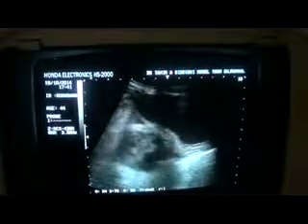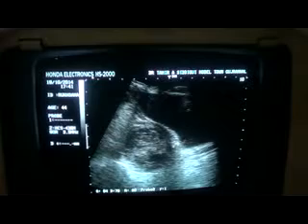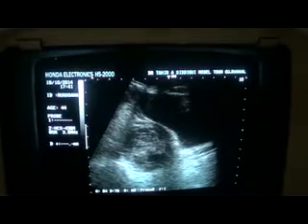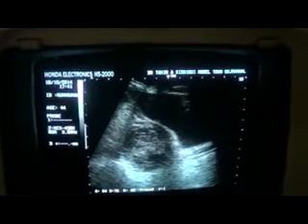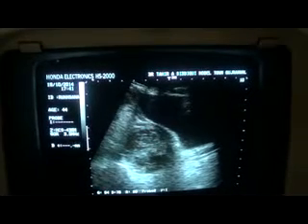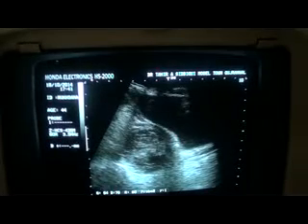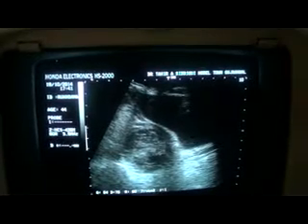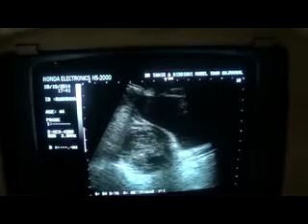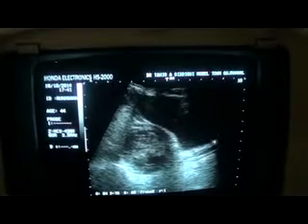Now, this is the vagina. This is the vaginal stump that was not tightly ligated, and we see a cystic and solid, predominantly cystic mass, because you see posterior wall acoustic enhancement, and these are echogenic areas with an inflammatory calcification or solid element seen. This is the bladder, urinary bladder. This is our case of study.